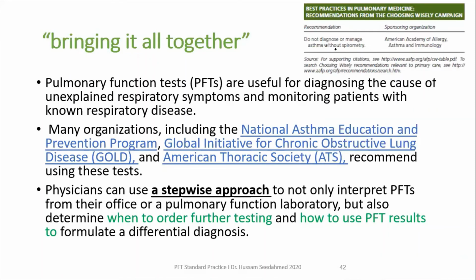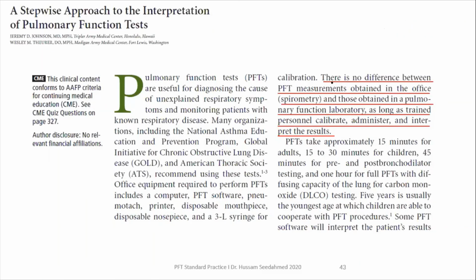One article, by the American Academy of Allergy, Asthma and Immunology, has a recommendation to not diagnose or manage asthma without spirometry. You should not diagnose or manage patients with asthma without spirometry. And from the same article, they found that there is no difference between PFT measurements obtained in the office and those obtained in the pulmonary function lab, as long as trained personnel calibrate, administer, and interpret the result.